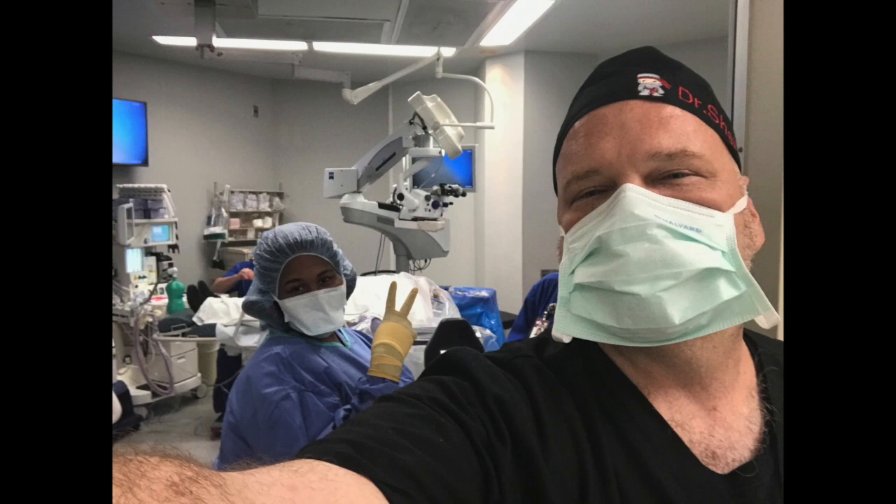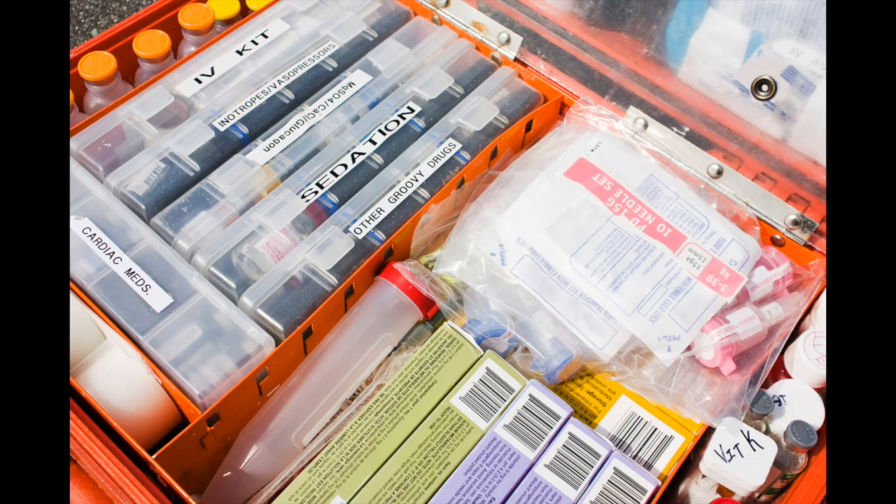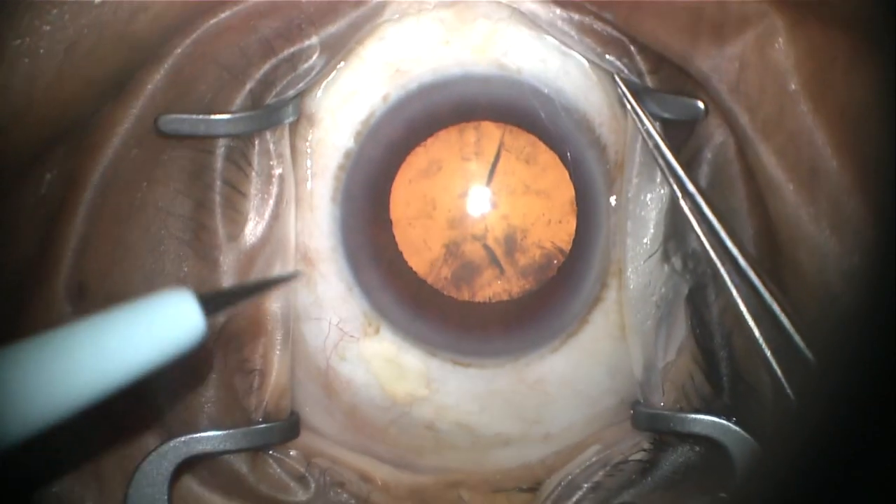You will then be rolled into the operating room where all the magic happens. Once you're in the operating room, we give you some IV sedation just to relax you. The surgery starts with one little bitty incision on the clear part of the eye where the colored part meets the white part.